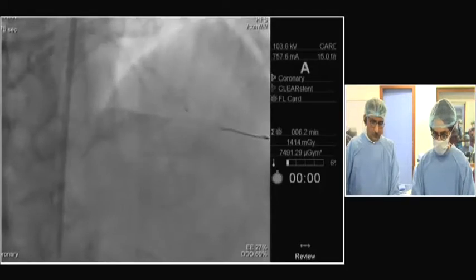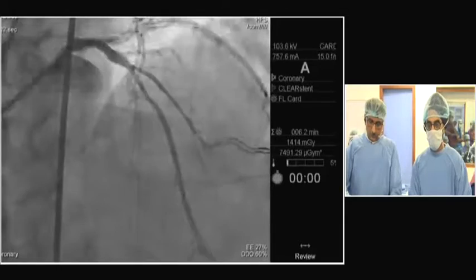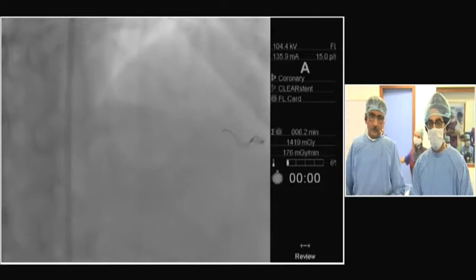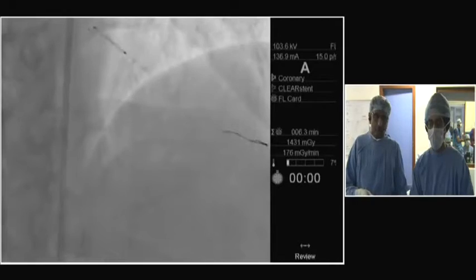The national faculty for you. I'm going to just make one comment, if I may. We saw left ventricular function was good, so the decision to leave the dominant right coronary artery alone seems perhaps one that could be challenged.